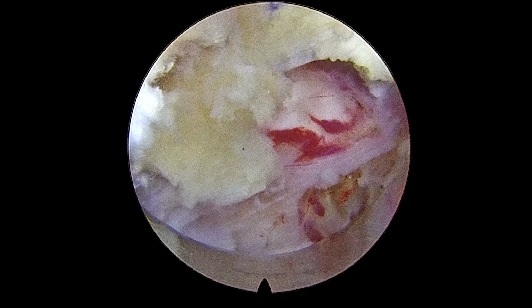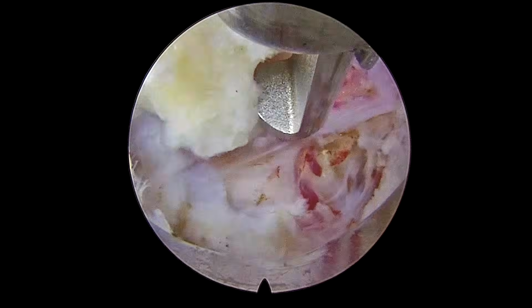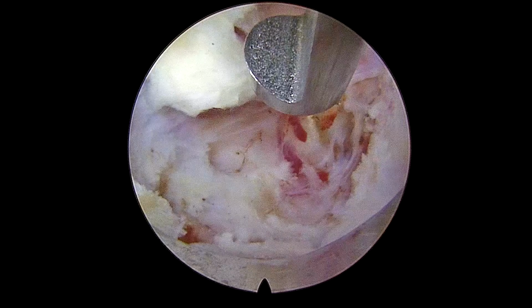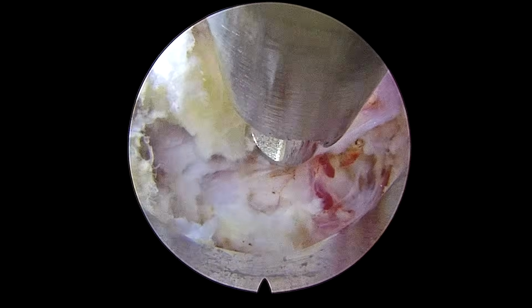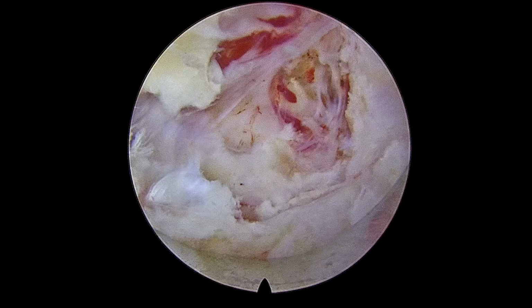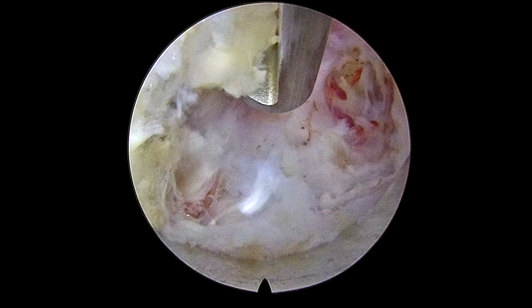Now as I got the complete overview of the nerve root and dura here, I am going to remove the ligamentum flavum, because now we don't need to do any bony decompression. So it is very safe at this stage to remove ligamentum flavum. It will again delineate anatomical structures clearly.